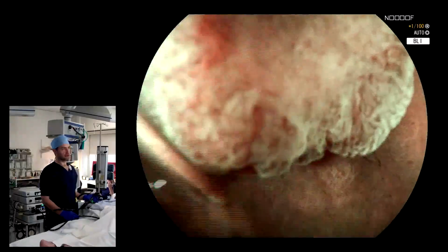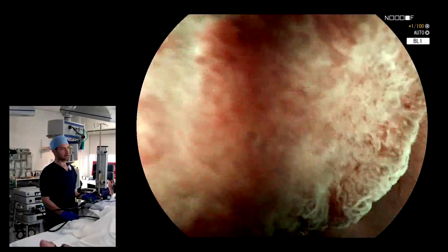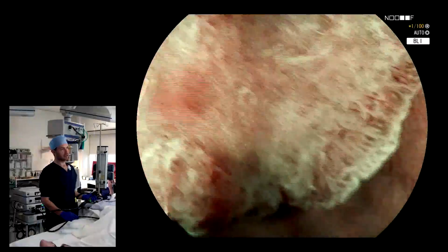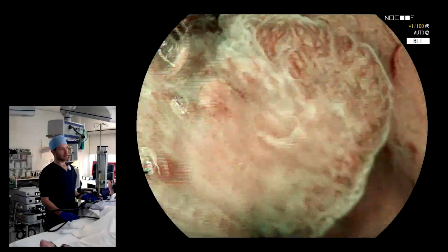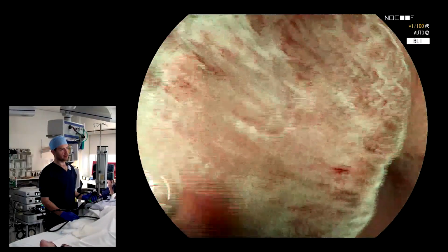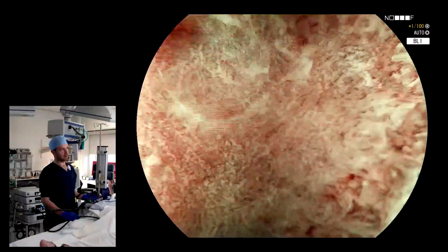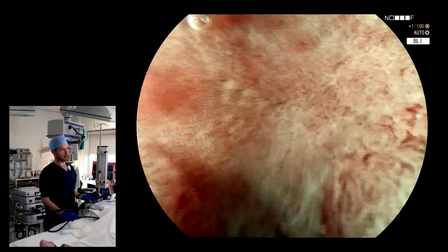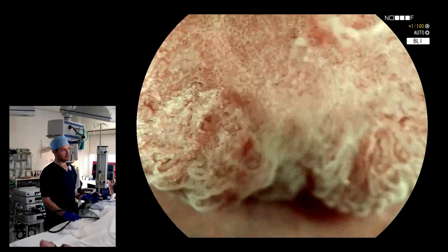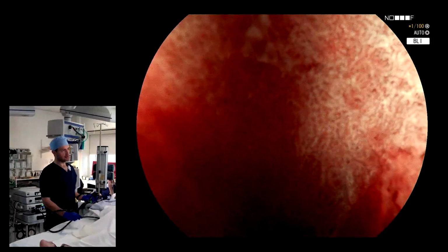when it's going in, obviously the thing is moving, but then when we stop the water pressure, potentially it's going to give us that natural magnification, but it's also probably going to let us see better contrast between that demarcation line and the edge, for example, like this. So already on 2 levels of zoom, and then here again we can beautifully visualize this edge the whole way around. It wasn't easy to see the bottom before, but if we use water pressure to just bring it into focus, then you can really also nicely see that area.